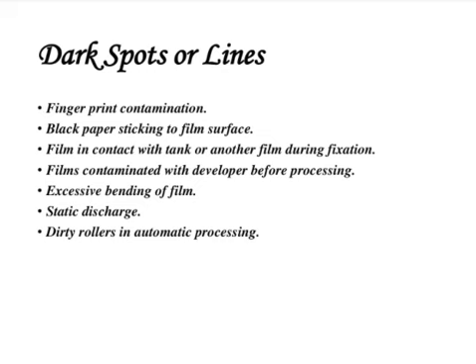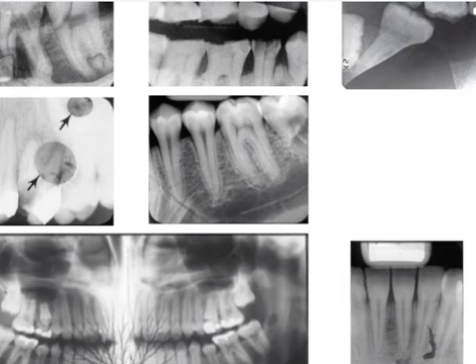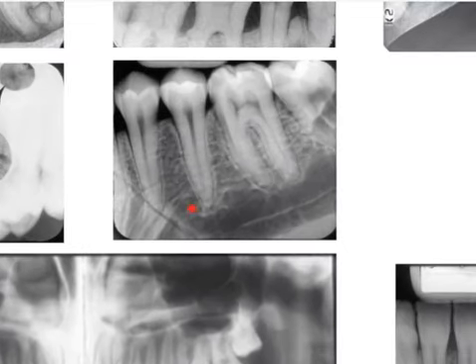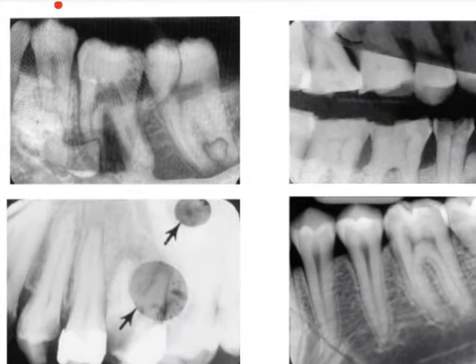So we'll see the images. We'll enlarge. If you see here, you can see some kind of fingerprint pattern. This contributes to the black line in the image. There is a light spot as well on the image, which is because of fixer on the film.